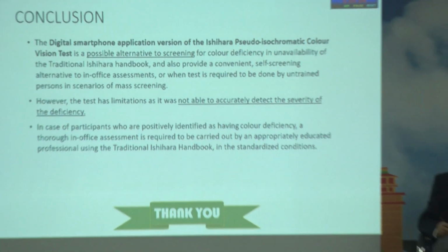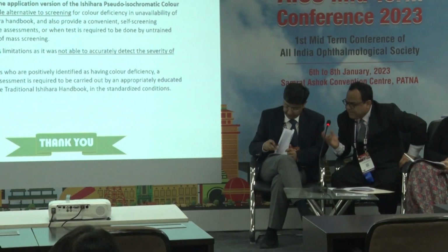Do you prefer direct ophthalmoscopy first, or indirect ophthalmoscopy first, or color vision earlier, in your practice? Suppose one patient is in front of you, do you prefer to do ophthalmoscopy first or color vision first? So we'll do color vision testing first, then we go for ophthalmoscopy.